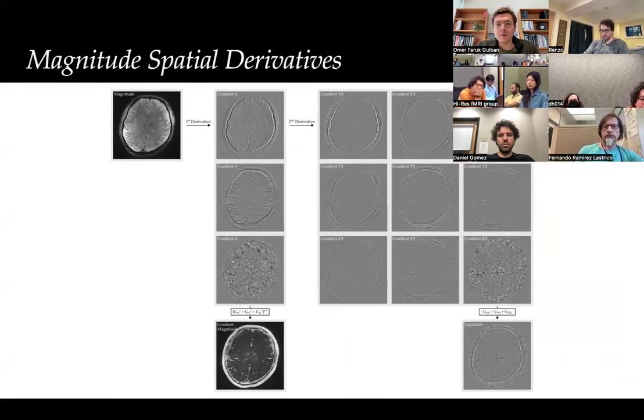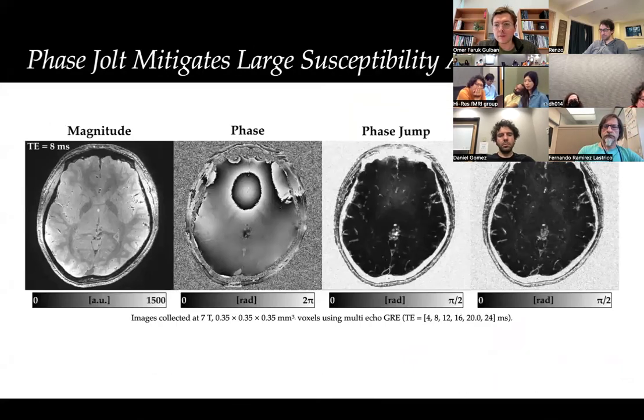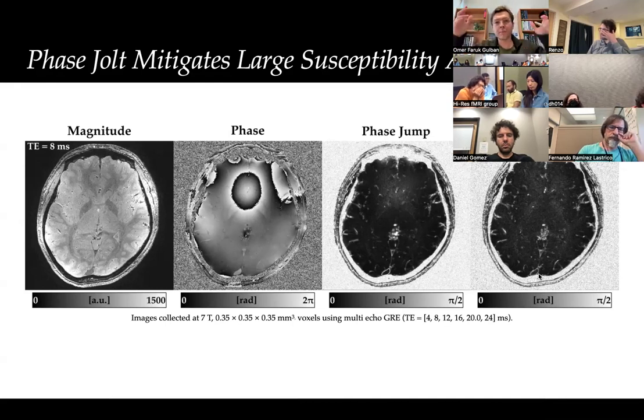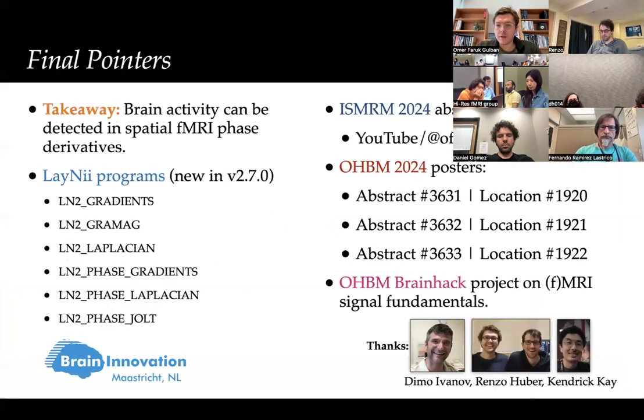One has to distinguish between the phase derivative giving a high response on a tissue boundary, versus its fluctuations over time, assuming no head motion and so forth. When you, for instance, Z-score voxel-wise across the time series, the image would look much more homogeneous. So one should not confuse the edge popping-up effects with time series fluctuations. Yep. Thanks.